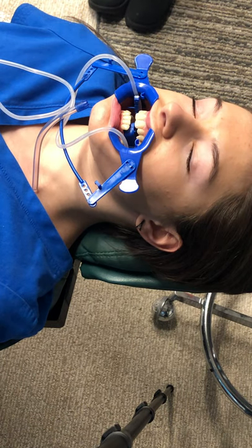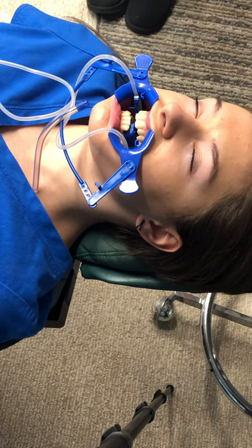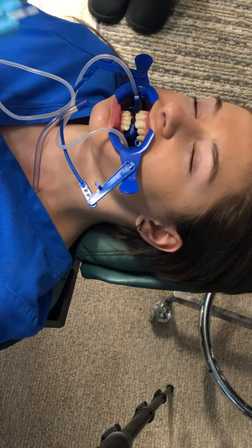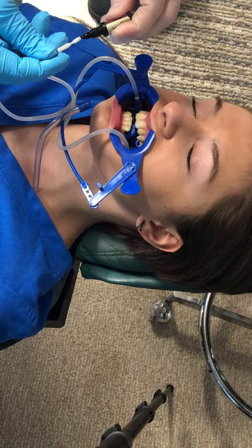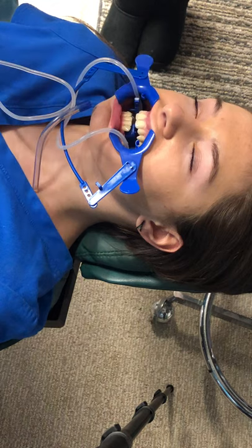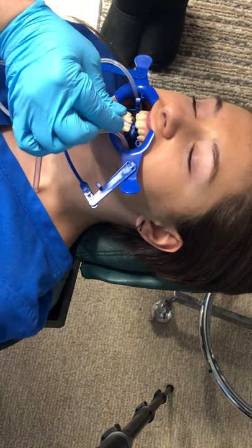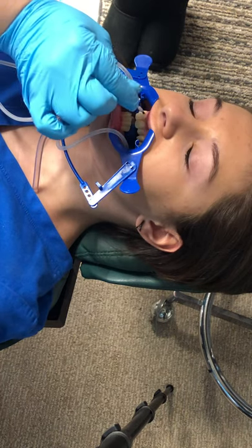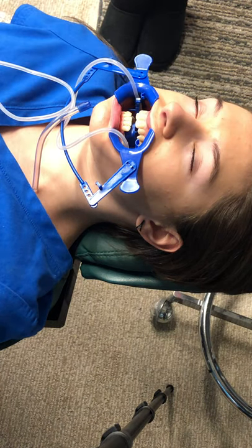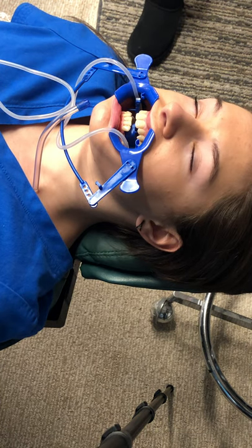Everything's ready for the enamel rods to receive the sealant. We're going to take the light cure sealant and put just a little bit on the brush. You've heard the term 'don't double dip' — if I touch your teeth, don't touch the brush to the sealant again. Put a little bit there and paint it just like you paint your nails — just a thin coat.